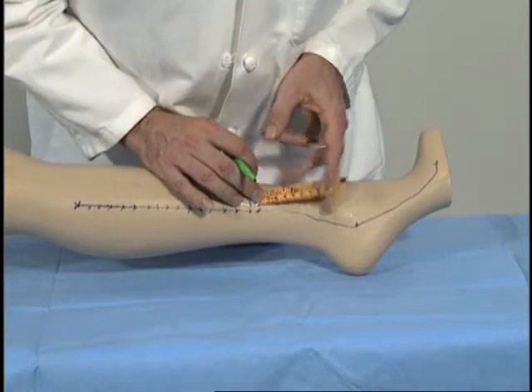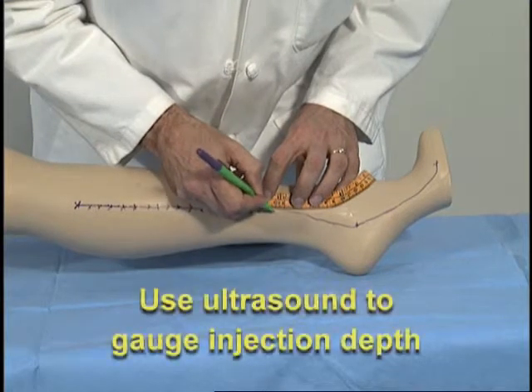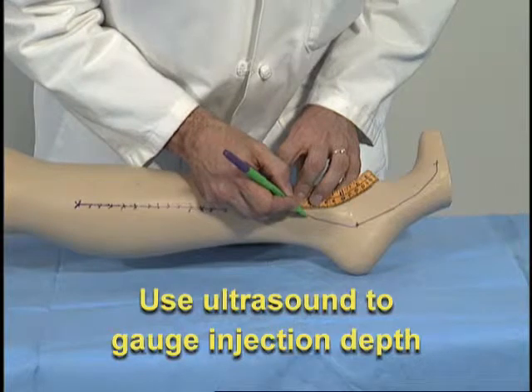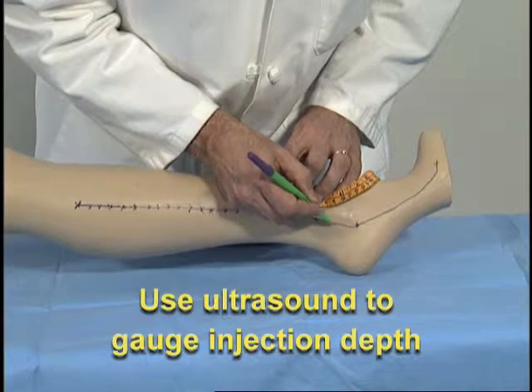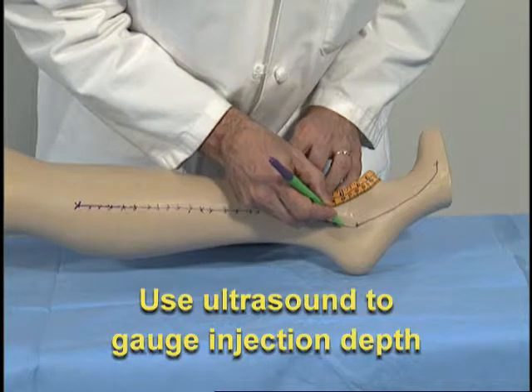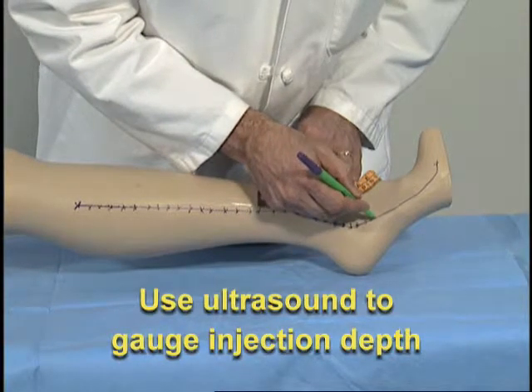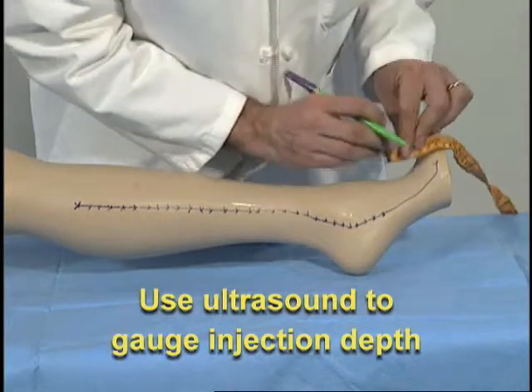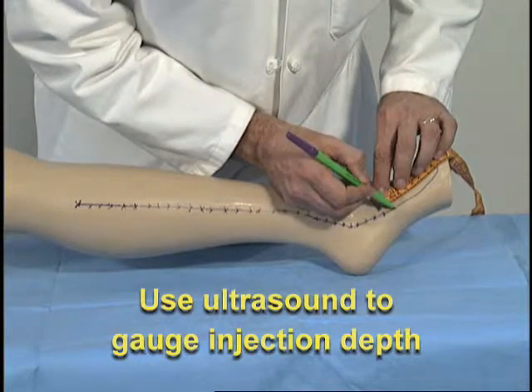When making these injections subsequently, ultrasound will be very useful in gauging the depth to your target. Although the area of the arteries will not easily be visualized by duplex, since obviously they're occluded, the accompanying veins should be easily visualized and should gauge your depth.